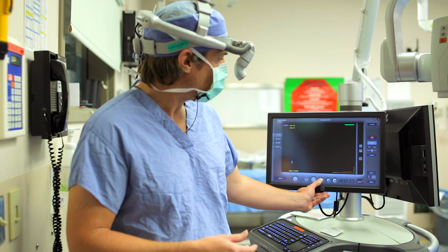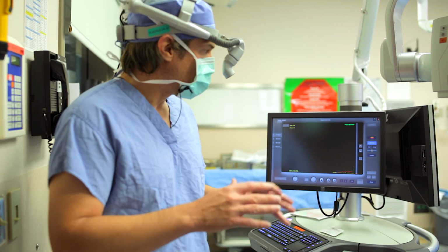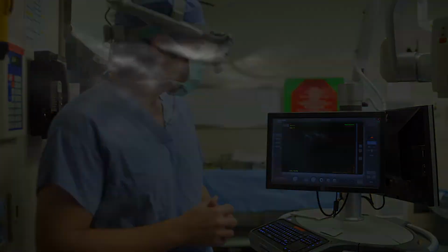So we're going to do another SPY image. Again, this is after all of the inset of the flap and the microsurgery has been done. You can see normal chest skin. You can see a couple of areas of darkness initially where there's some stress from the old mastectomy flaps. But you can see this SPY image shows that that flap has got arterial inflow. And you can see the cutaneous perforators in the flap itself. And you can see that the medial portion of this flap is perfused very well.